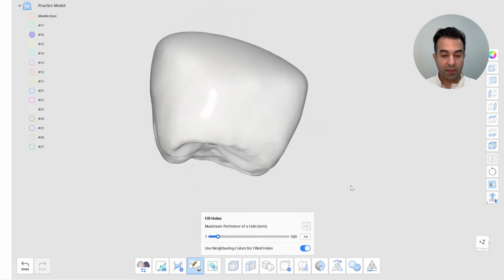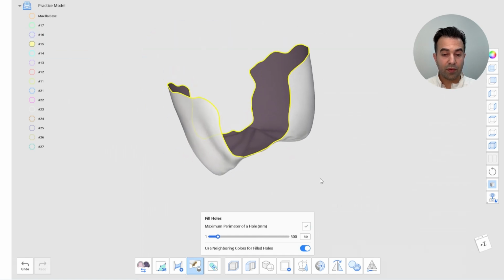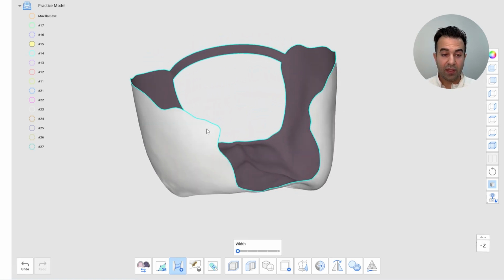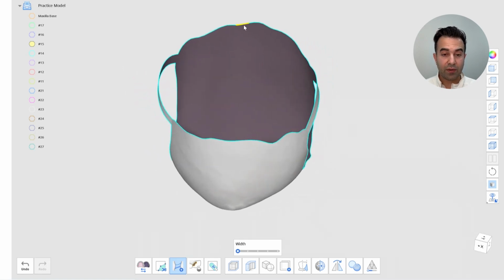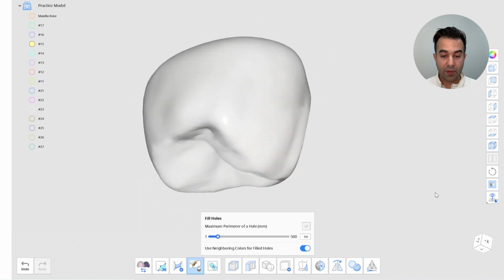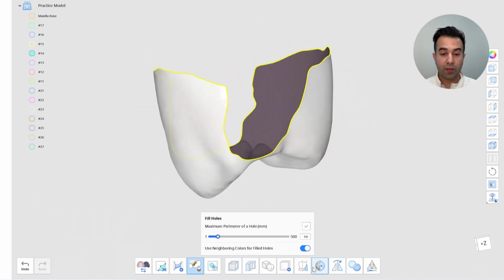And that's a 3D upper right first molar. Let's move to the premolar. Make the tooth that you made into a 3D object invisible and make the adjacent tooth visible using the tree data on the right, left hand side. So you can see now we're repeating the same process. Bridge, bridge, bridge, followed by fill holes.